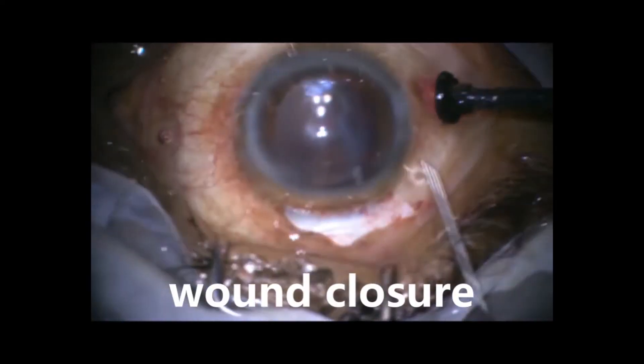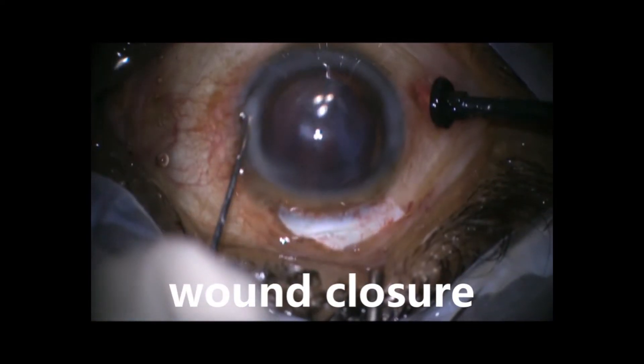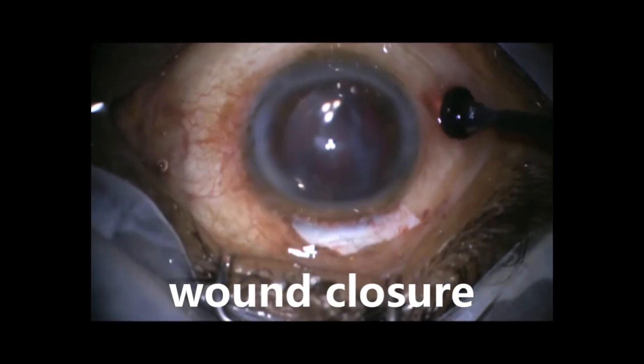IOL implantation was done. Post-operative visual acuity was 6/12 and N8.